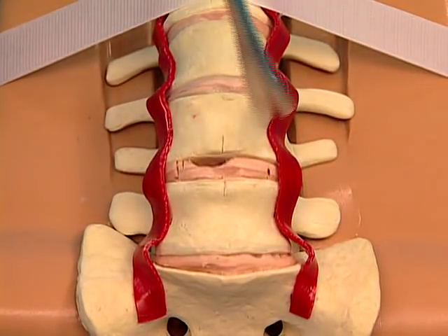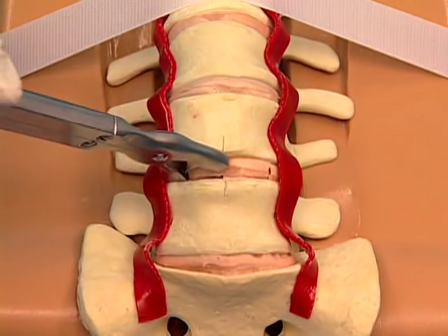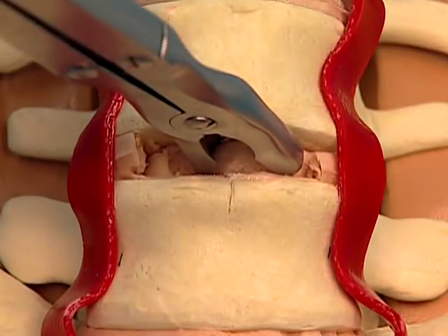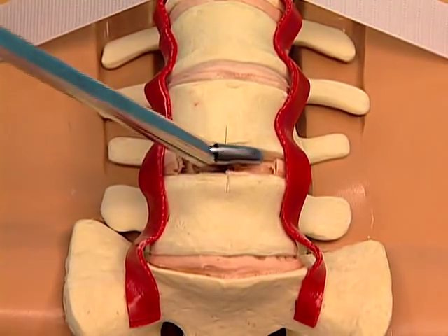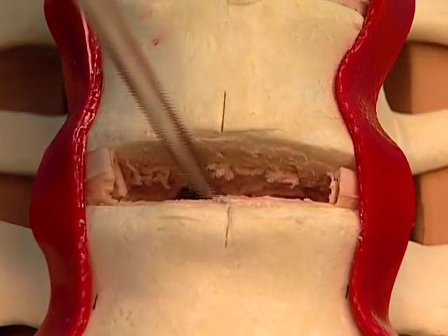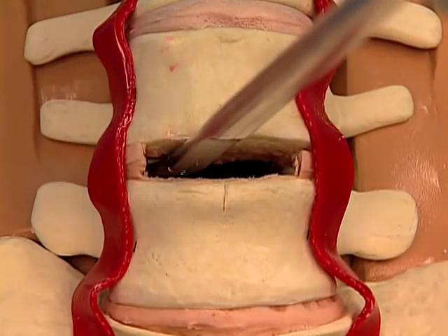Use the bone elevator to separate the disk from the end plates. Perform a thorough discectomy using standard anterior discectomy instrumentation, such as rongeurs, Kerisons, and curettes. The goal of a total disc replacement discectomy is to free the posterolateral corners of disc material and to completely expose the posterior longitudinal ligament.